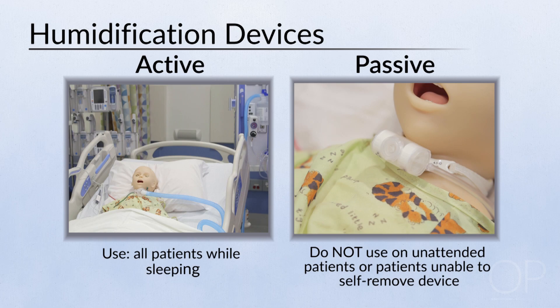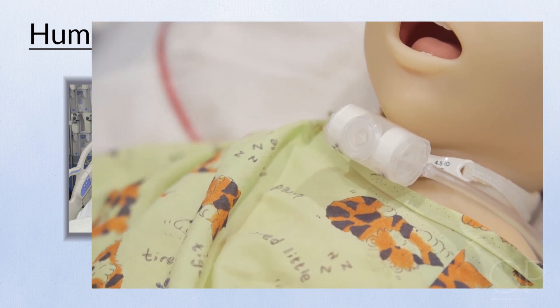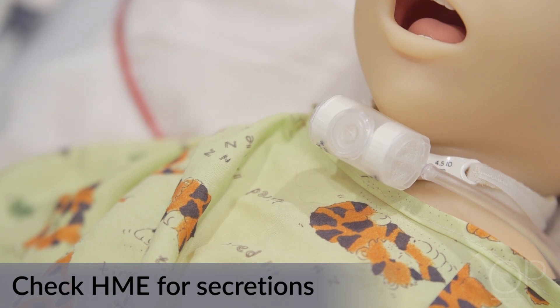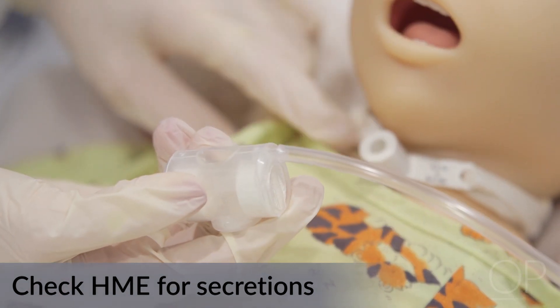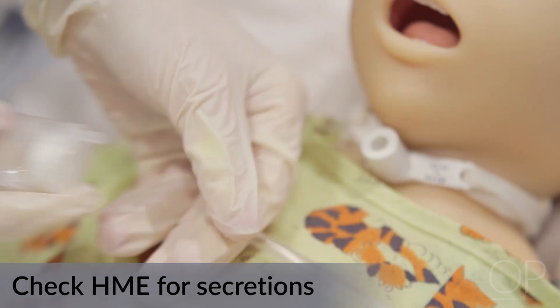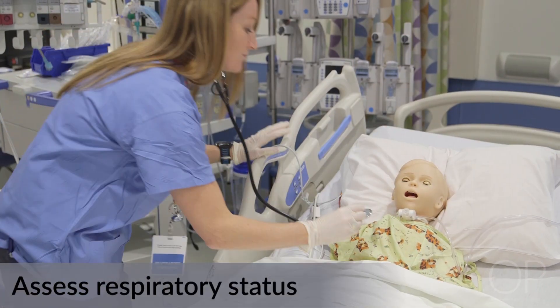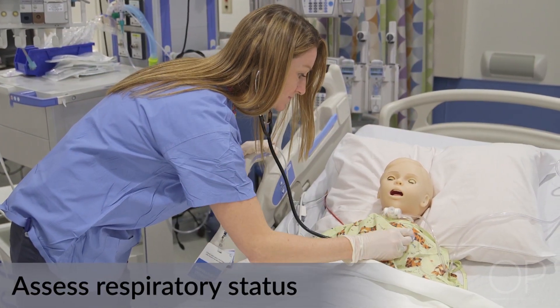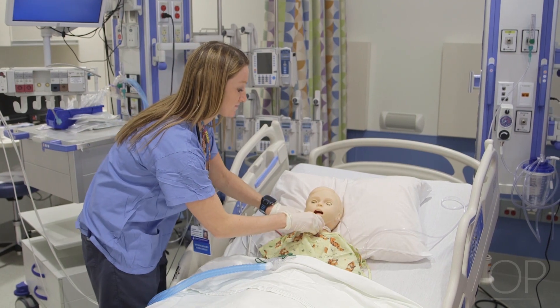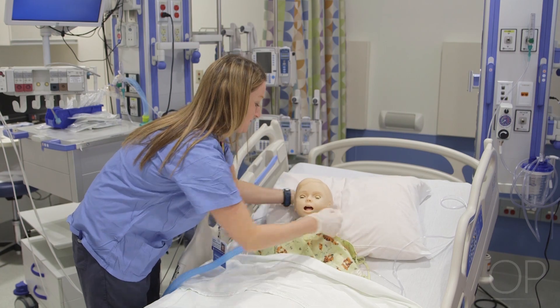An example of a passive humidification device is a heat-moisture exchange, or HME, device. When utilizing an HME, check periodically to assure that it is clear of secretions. Replace the HME if secretions are visualized. After applying an HME, assess for changes in respiratory status, including work of breathing and tachypnea. Consider decreasing the use of an HME or changing to an active humidification device if there is an increase in the viscosity of airway secretions.